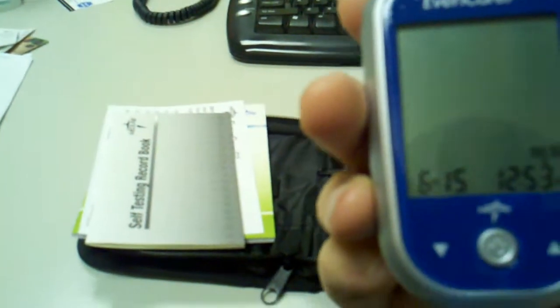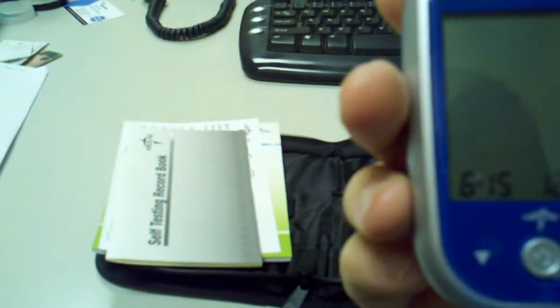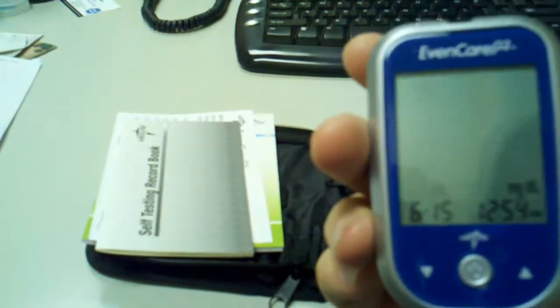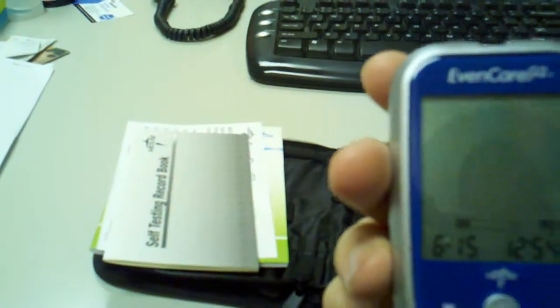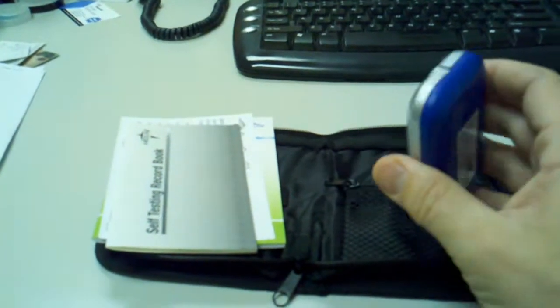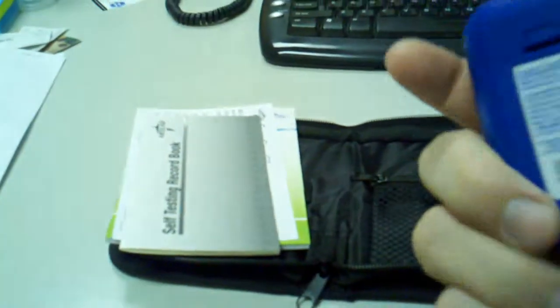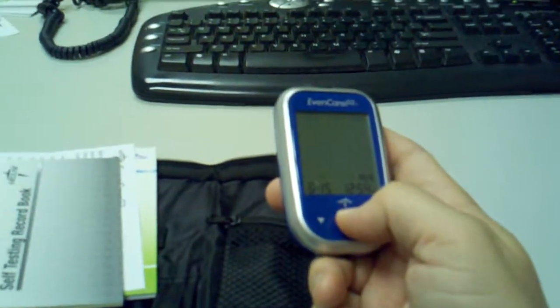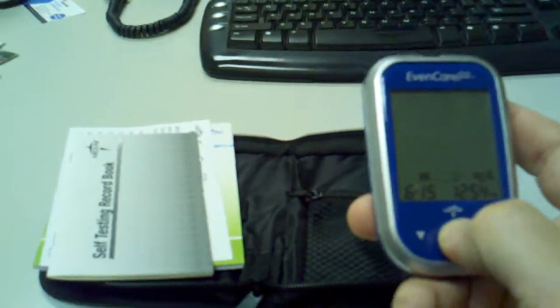As you can see, it has a time stamp with the date and it automatically generates right when you turn it on — see how quickly it came on. You put the test strip right in there and it'll read it in less than 10 seconds. That is the EvenCare G2. If you have any questions, call us at 855-528-2539. Thank you.